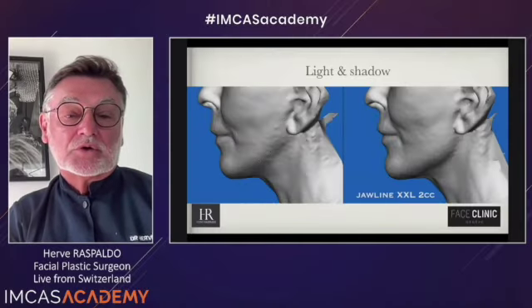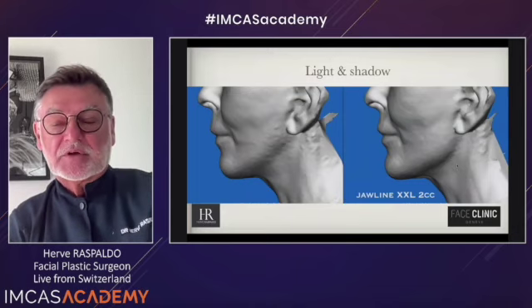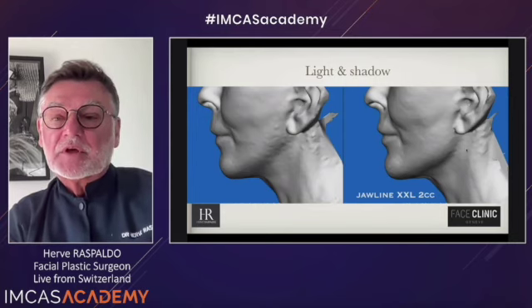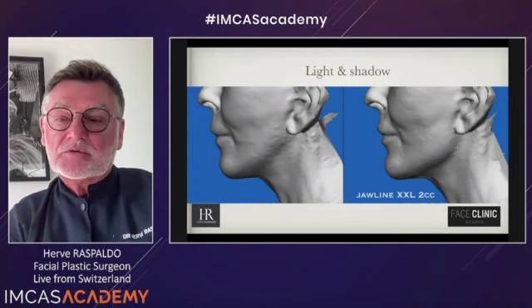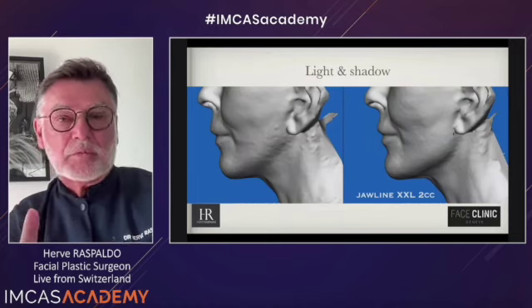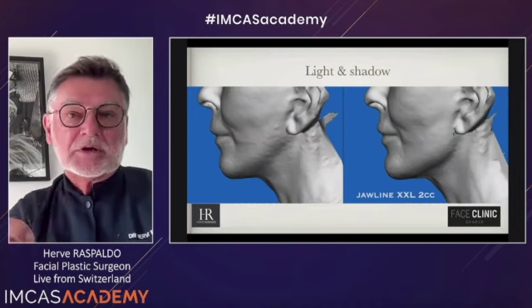With no contour of the jawline, no gonion. It's like a J. Now we do like an L. You see, with 2 cc of double XL, and I love this product because it's really the strongest one with the highest G prime, and you can sculpt, not volumize. Forget the term volumizing and volume. We're talking about sculpting, contouring, and projection.